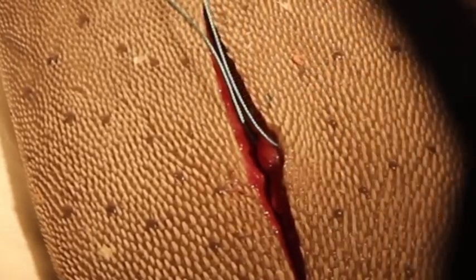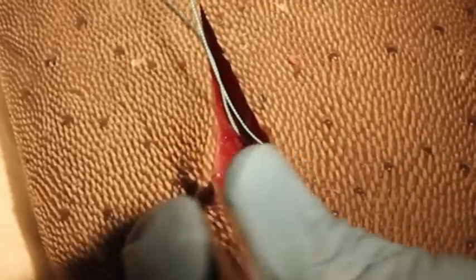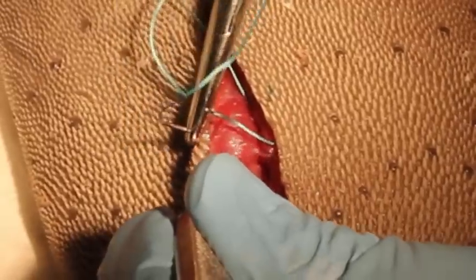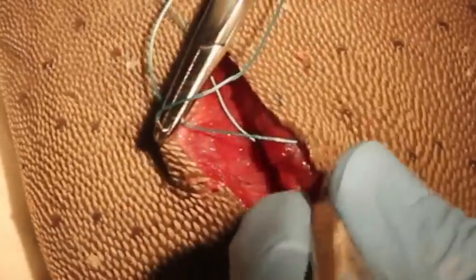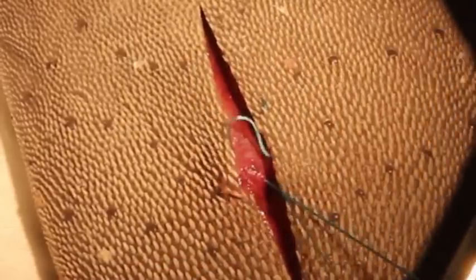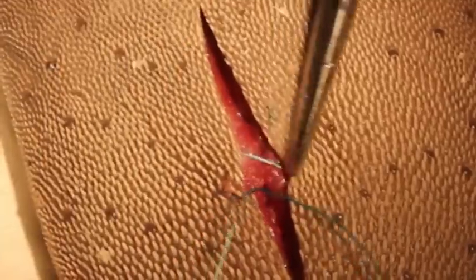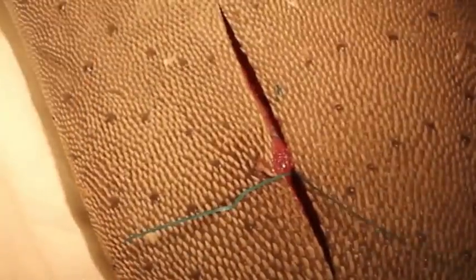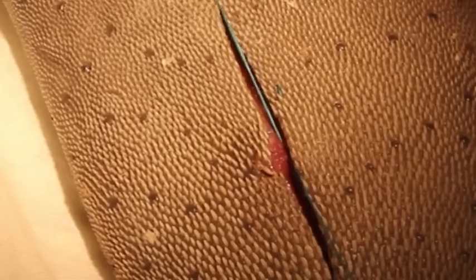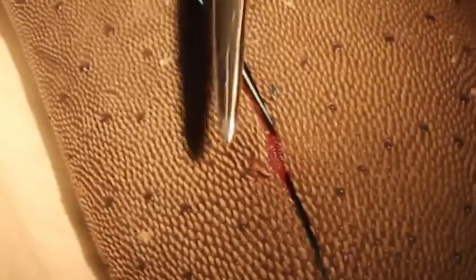Now we want to go on the other side, again through the subcuticular, down to the base of the wound. It's very important that both threads of the stitch are on the same side of the stitch. We wrap it twice, and when you pull, you want to pull in the direction of your wound — we approximate like this and the wound will close.